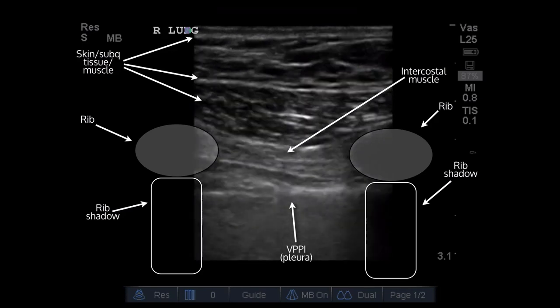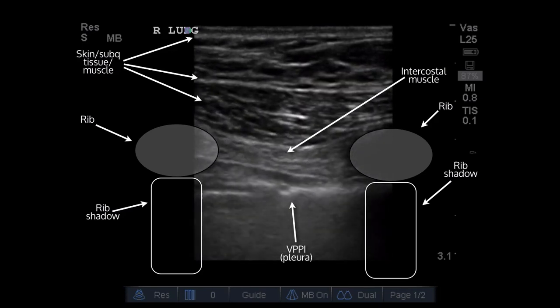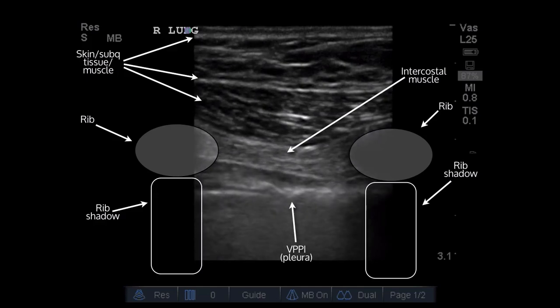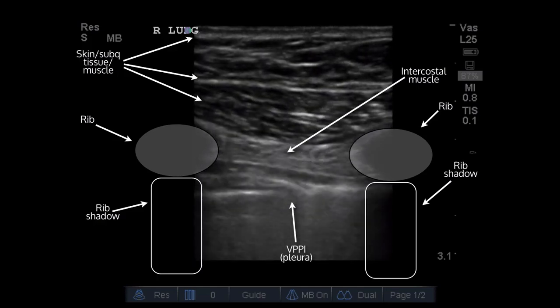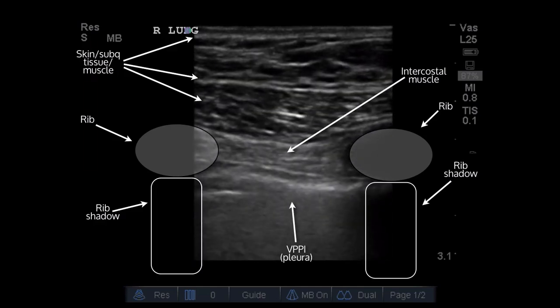Some people have called it ants marching, lung gliding, or lung sliding. Really just: is it moving back and forth? Is it sliding? That's the most important thing.